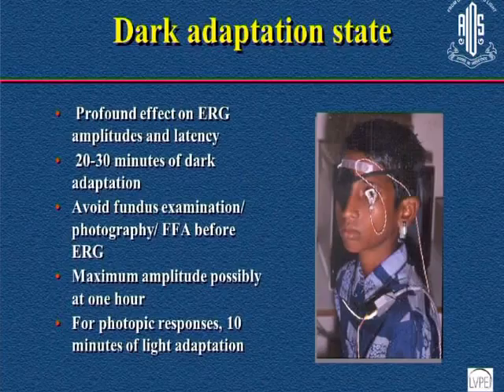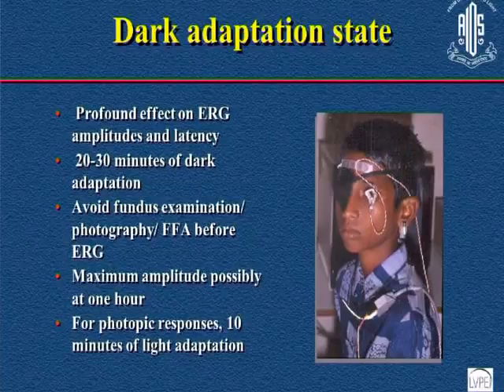Then dark adaptation state. This has a profound effect on your rod ERG. If the patient has undergone fundus photography or indirect ophthalmoscopy before your ERG, it bleaches the retina and it will take almost a couple of hours to recover. So you should avoid fundus examination or photography just before you do ERG. If you do, then you have to do more dark adaptation.